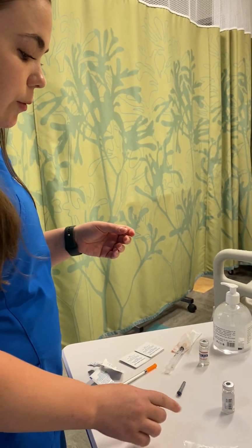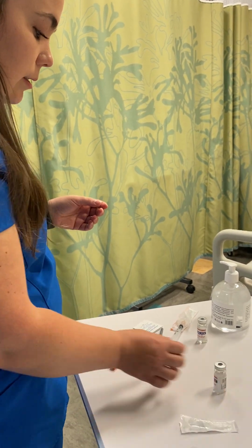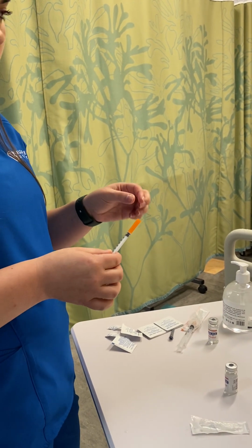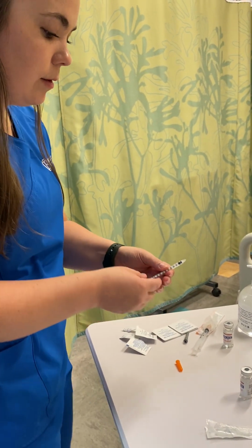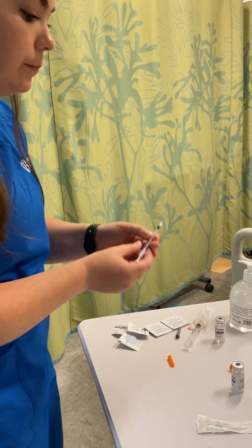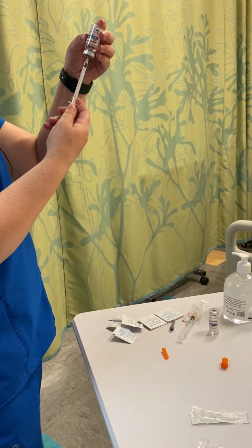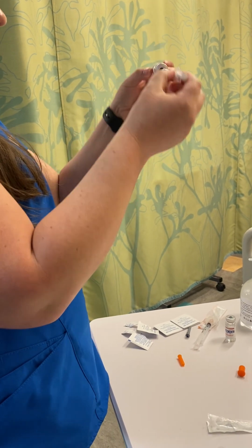And then moving on to our subcutaneous injection. It's already been cleaned. I would take our insulin syringe. The dose is 10 units from the medication record. We would draw back the air, hold it down, and insert above the solution. And then withdraw the appropriate amount, plus a little bit extra for air.